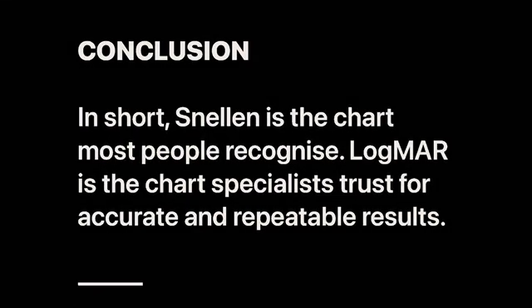Conclusion. In short, Snellen is the chart most people recognize. LogMAR is the chart specialists trust for accurate and repeatable results.